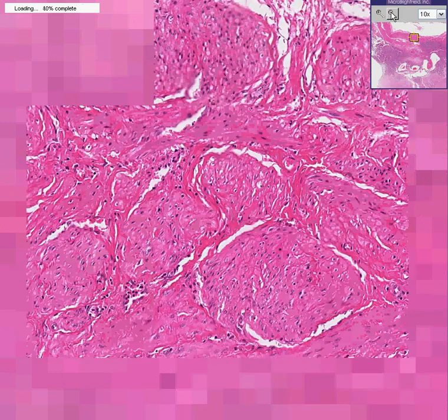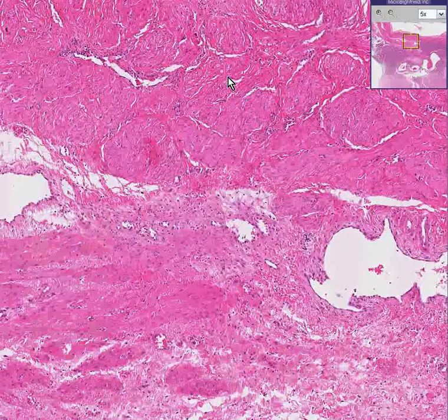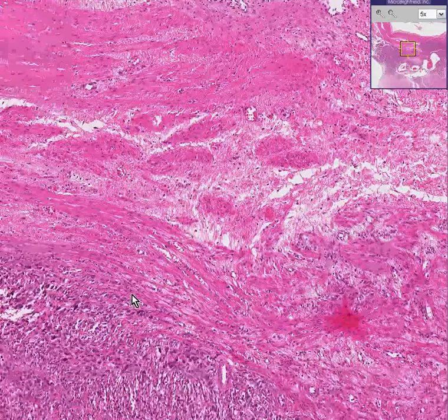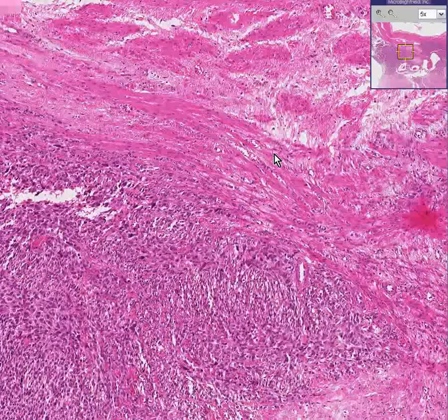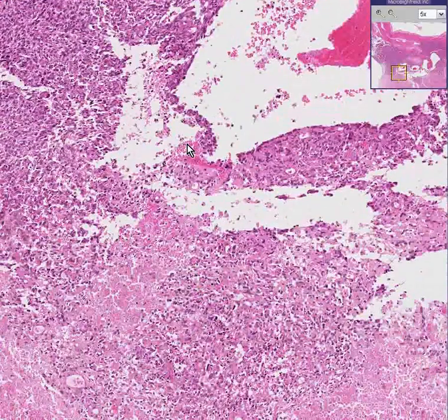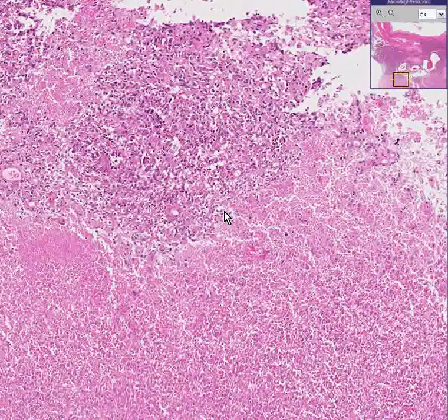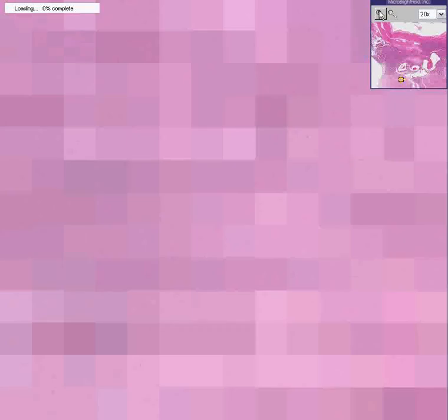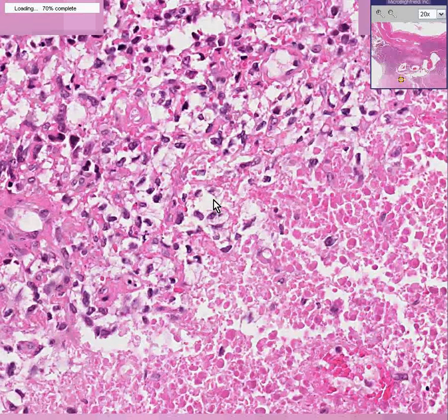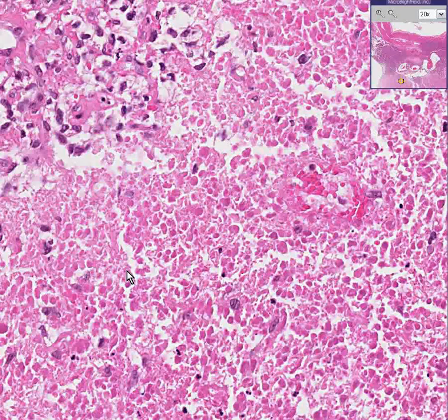There's another feature in here that is not the most important feature. Here's the normal smooth muscle, here's some more normal smooth muscle, here's the leiomyosarcoma. In addition, there's one other feature here that's common with many tumors, benign and malignant, but generally more so with malignants. You see an area of tumor where you can't really make out the configurations of the cells — maybe here you can, but maybe here they're all ghosted. That's necrosis. Thank you very much.